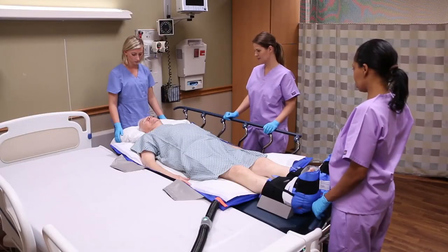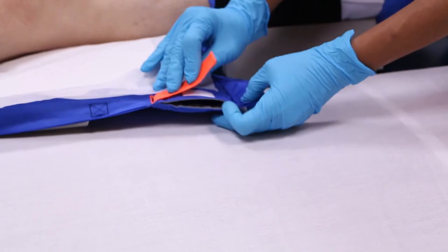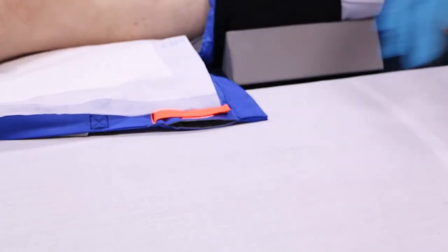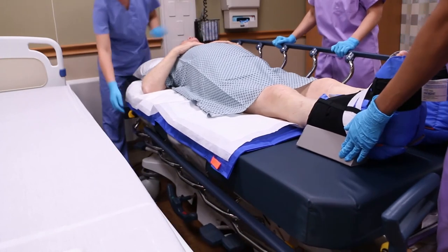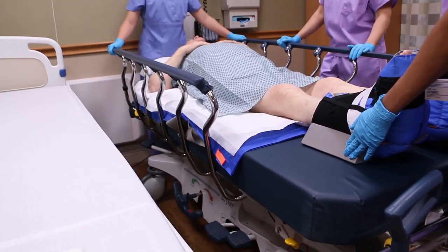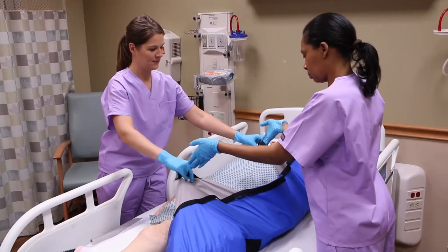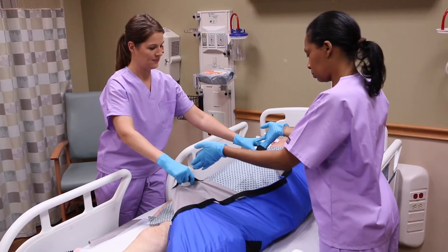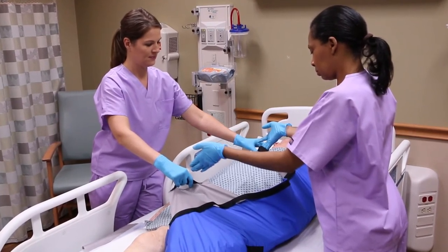Turn the booster pump off. When the glide sheet is fully deflated, remove the hose. Separate the support surfaces and raise the bed rail. The gray extension handles on the glide sheet can aid with patient positioning in conjunction with your facility's safe patient handling protocol.